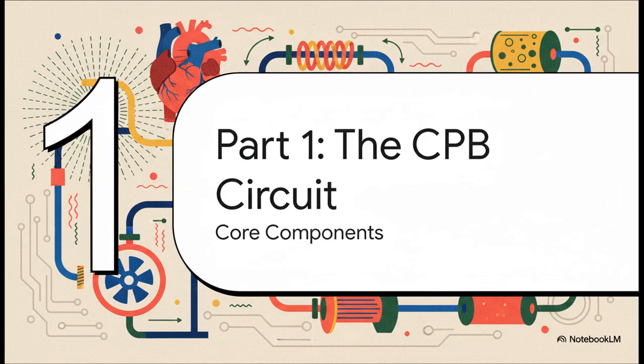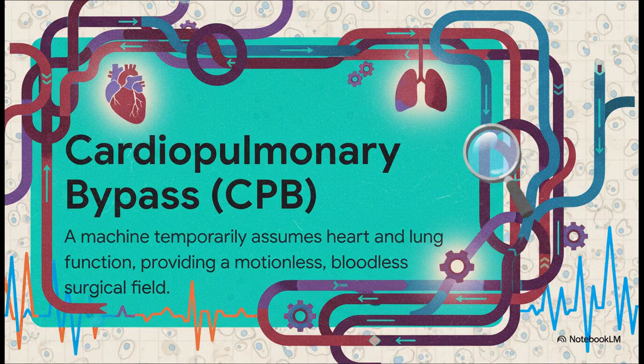If you really want to master bypass, you have to start with the circuit. You have to know it inside and out. A deep, technical understanding of these components is the absolute bedrock for anticipating problems and keeping our patients safe. So what are we really talking about with cardiopulmonary bypass? At its most basic, it's a form of extracorporeal circulation.